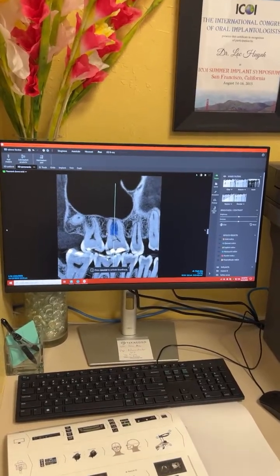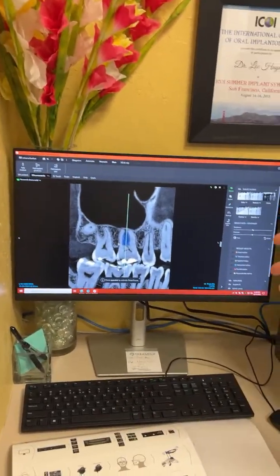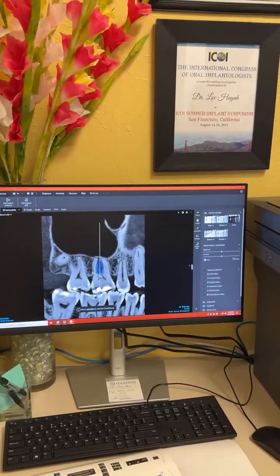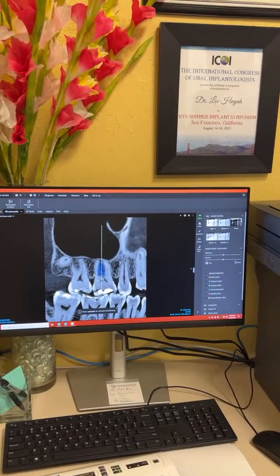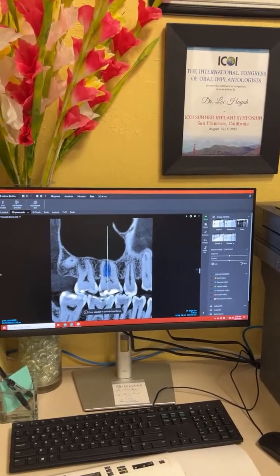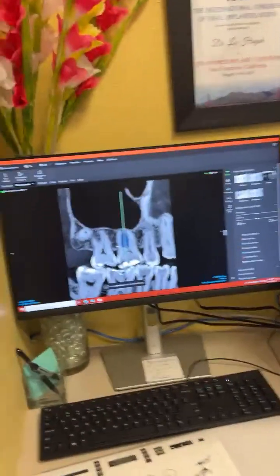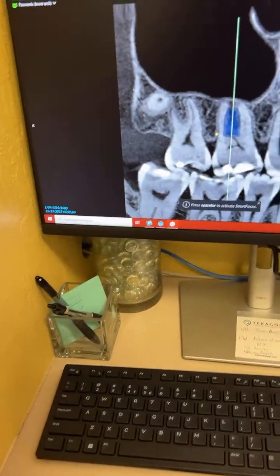The rest is going over the software and how to use it for planning. Any questions you have, of course, the time is yours to use as you want. But I don't think you guys need to be here for 4 hours to go over positioning. Right. And I've given you probably 75% of what you need, maybe a little more.